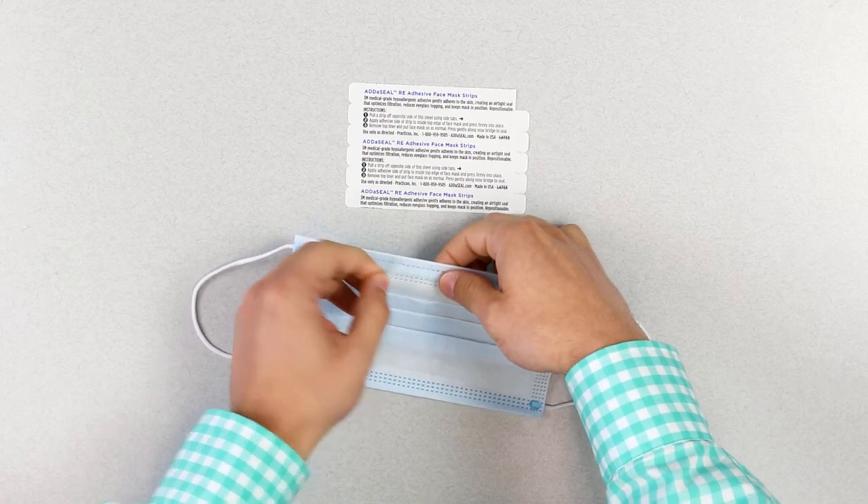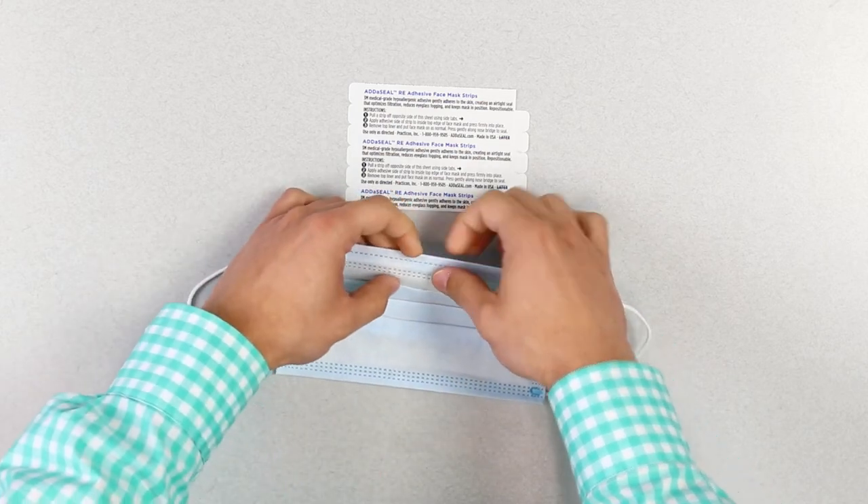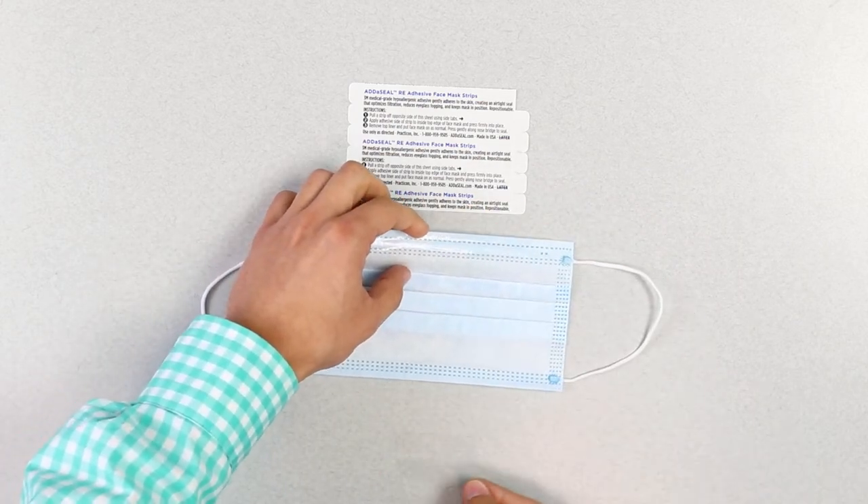Simply peel and stick Add-A-Seal onto the nose bridge of your face mask, remove the liner to expose the hypoallergenic adhesive. Don your mask and press gently over the bridge of your nose to seal.